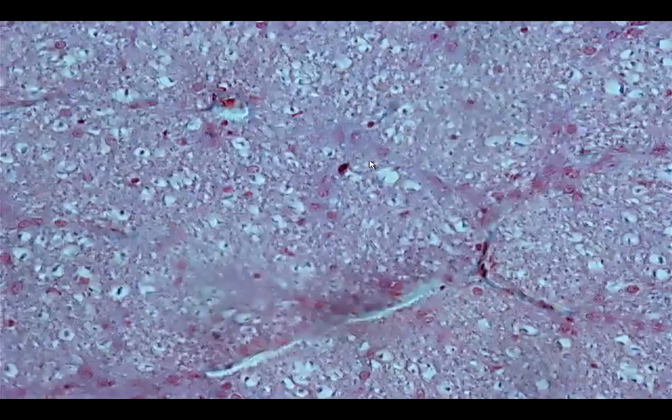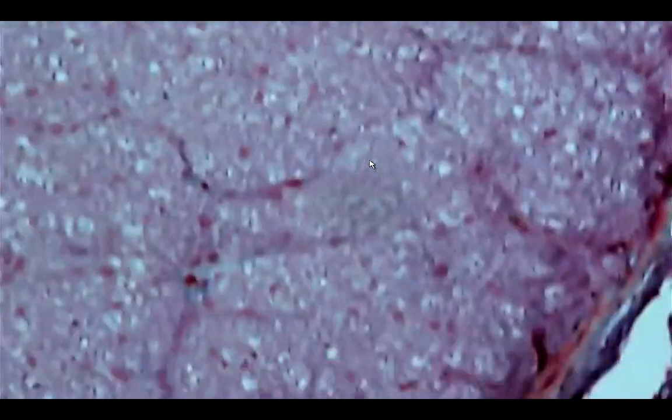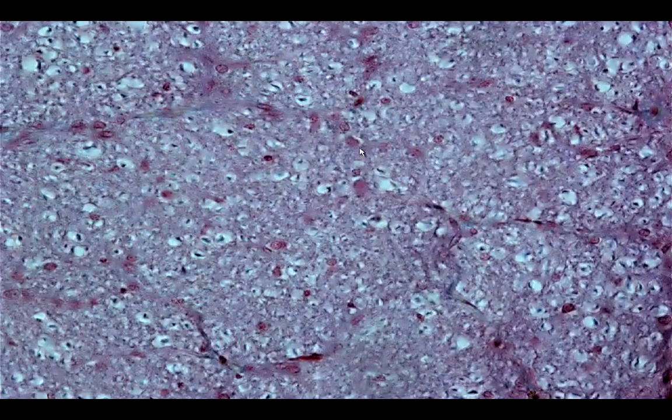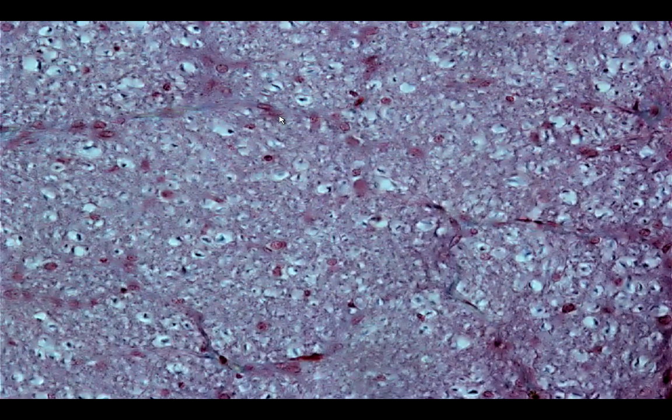And then this time, you would be able to identify some nerve fascicles. Okay, here. So you have the nerve fascicle over here, which would be surrounded by this specialized connective tissue, which would be called the perineurium. So this perineurium is special because it is a blood nerve barrier.